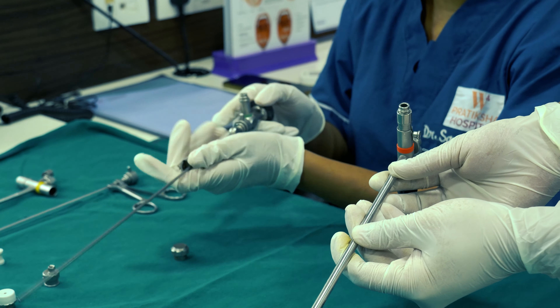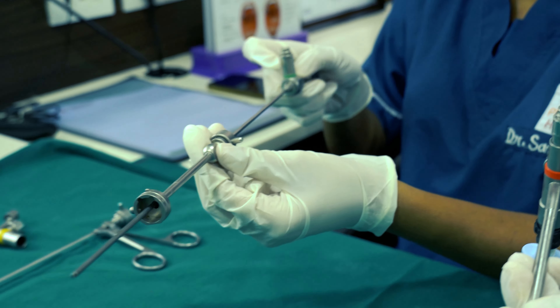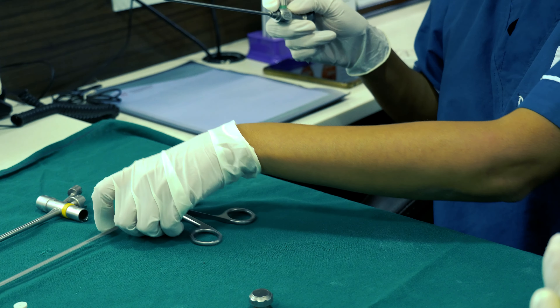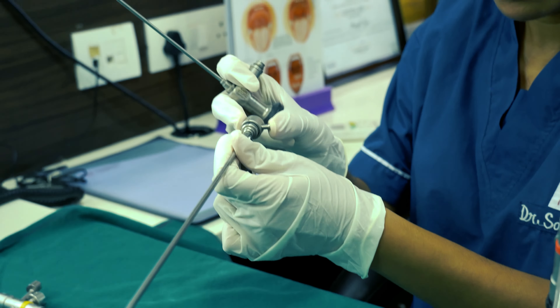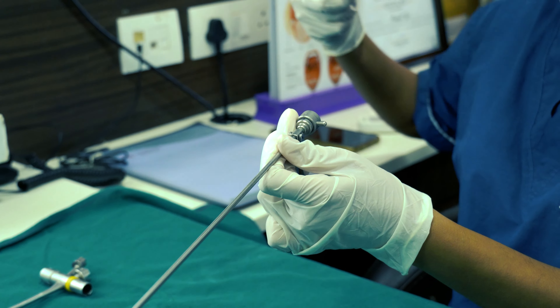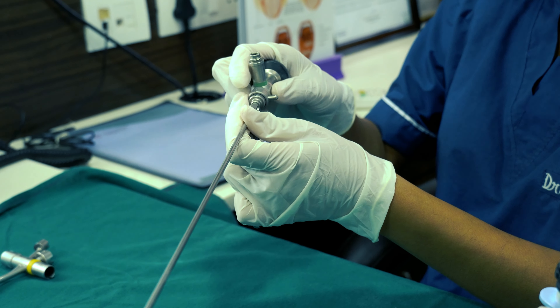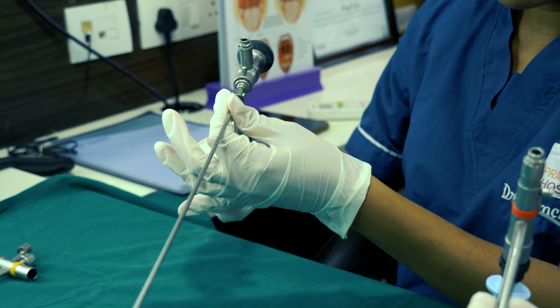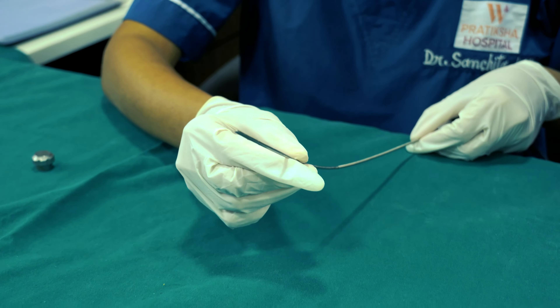One assistant will have to hold the bronchoscope in place — kindly hold it here. Now I'll have to mount the optical bronchoscope. Before that I have to disconnect the bridge the same way — this has to go laterally. Bring the bridge out. Now I have to take the optical forceps. This will stay laterally, this will stay up, and this scope will go into the optical forceps inside gently and linearly. For locking we have to again push it upwards — now this is a locked assembly and the optical forceps is ready.